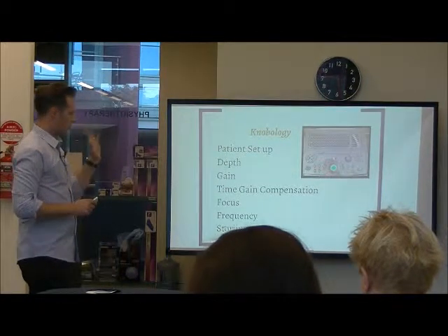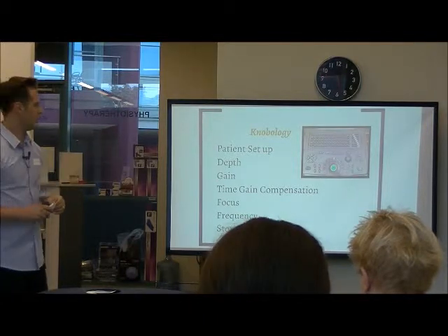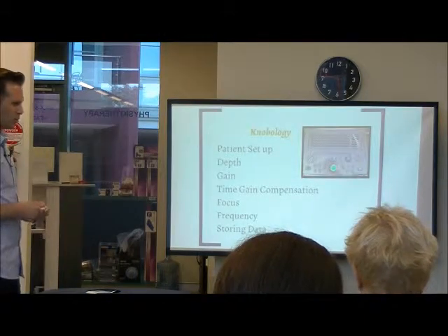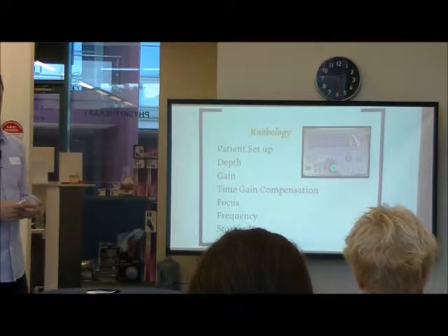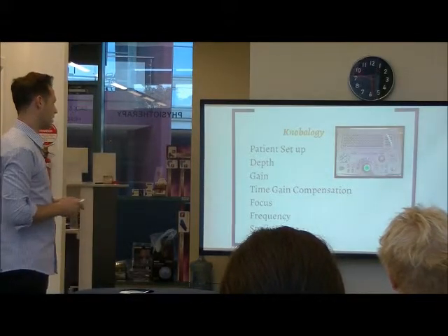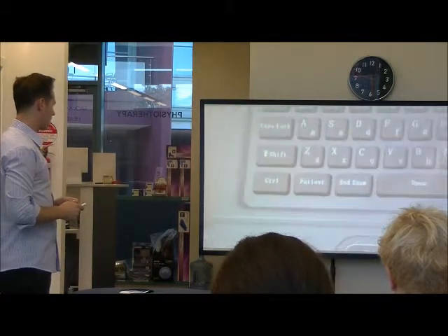Let's get into talking about the real basics, and then we'll get our hands on the ultrasound machines and start to use them properly. Knobology is a great name for a study of knobs, I guess. The knobs on most ultrasound machines are fairly similar, even though every ultrasound machine is going to be a little bit different. And we'll go through the ones that are really important for us to know as physios and for setting up our patient.